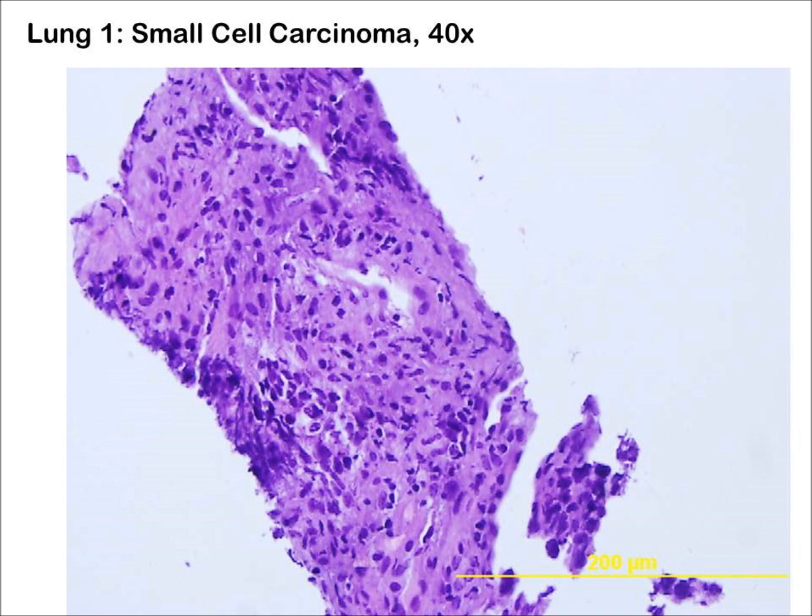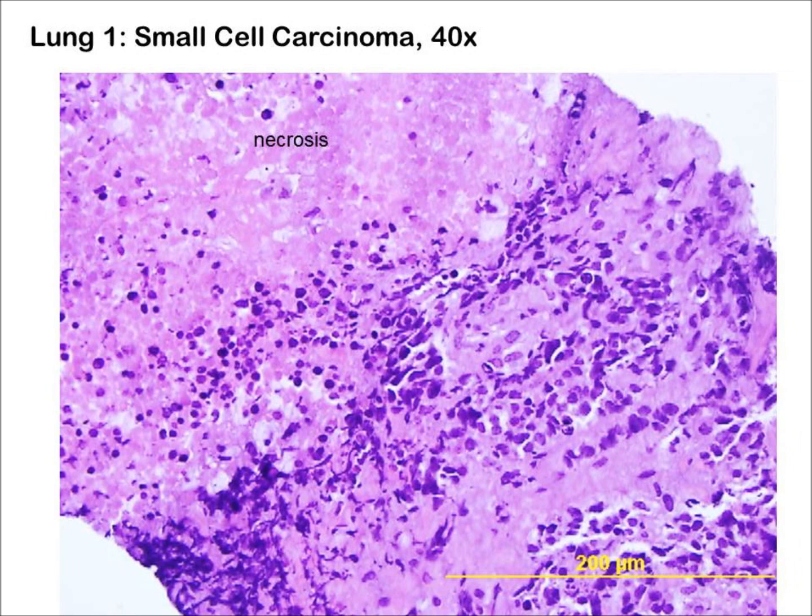In some regions, you may observe tumor cells that appear to be smudged. These tumor cells are fragile and smear easily when biopsies are taken. Indeed, this is one of the diagnostic features of small cell carcinoma. Next, locate one of the larger fragments on the slide. Here you will observe that the tumor cells are arranged in clusters and are surrounded by large areas of necrosis, which is marked by large eosinophilic regions that lack nuclei. This is also a characteristic feature of these tumors.